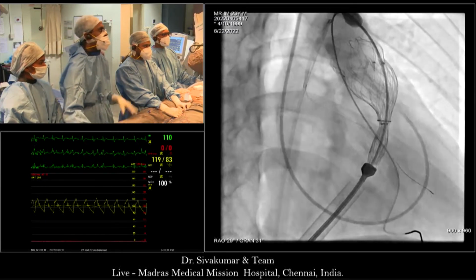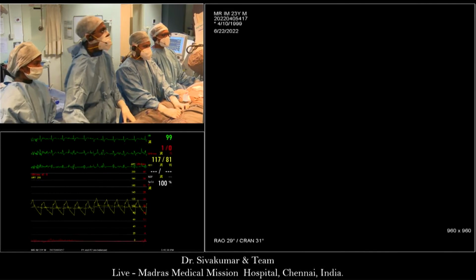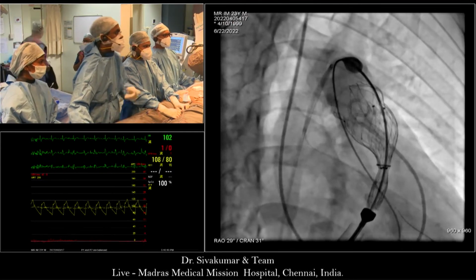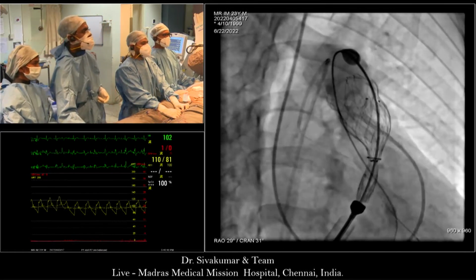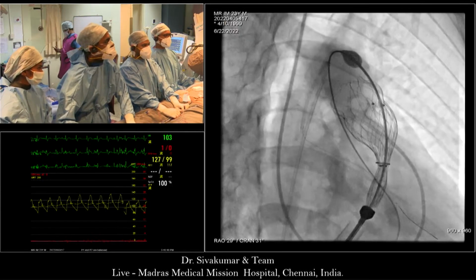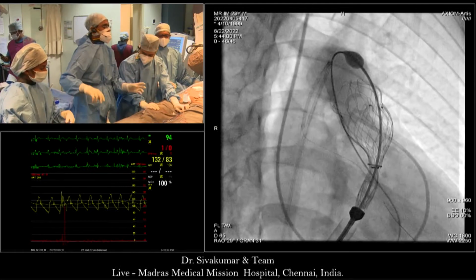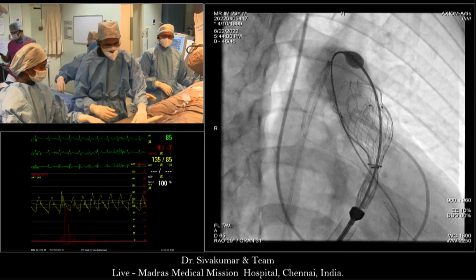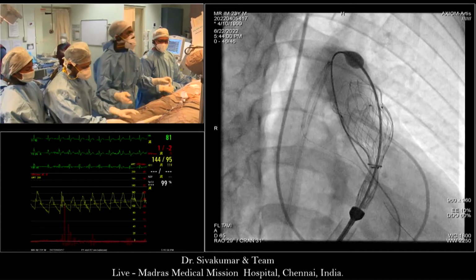That's an important point, Vivian, and that's one of the reasons I was suggesting RPA, because it's a little less, if you look at the angle between the axis of the valve. Steve doesn't obey you, Chuck, never. Come this side. Now, Gaurav, you have to start clockwise rotating. One more question.